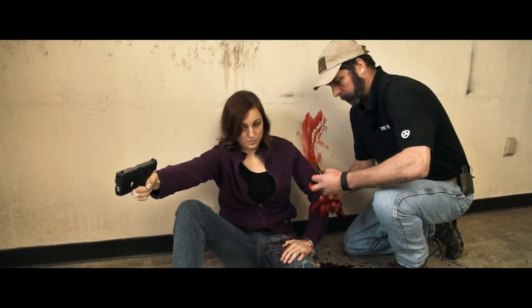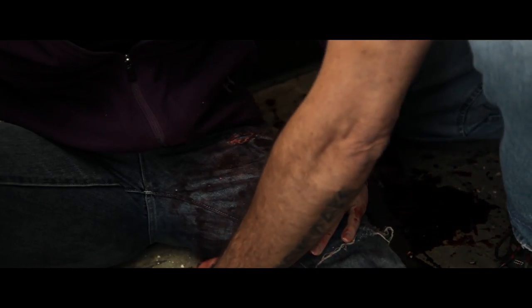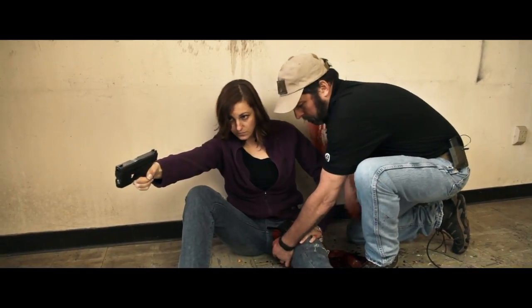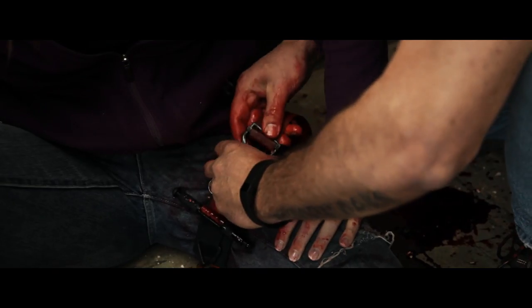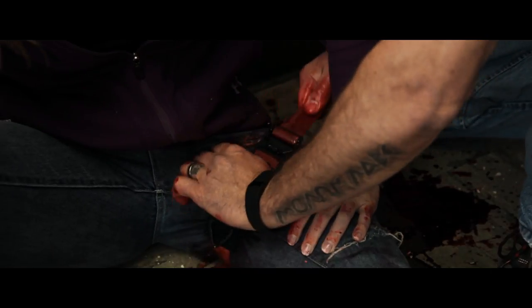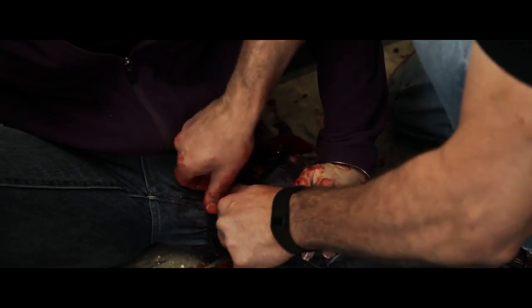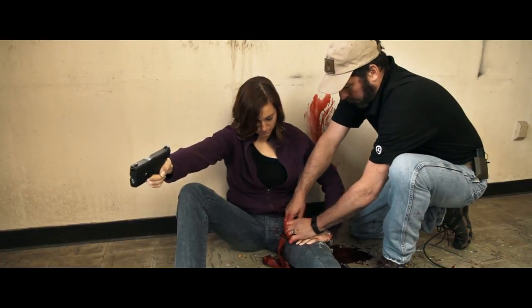This is the soft tactical tourniquet. When you place it, you want to get it high and tight on the extremity. There's a small ring which hooks here, clicks into place, and then you cinch it tight. You take the windlass and you twist it until the bleeding is controlled.